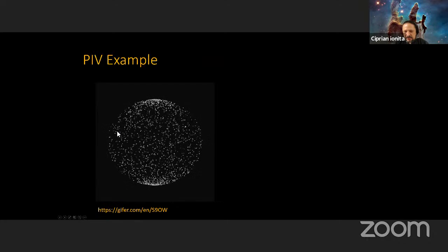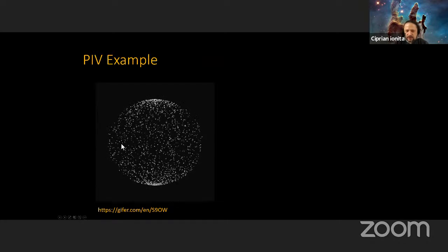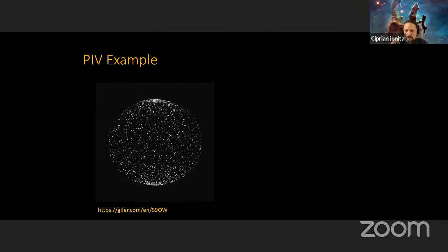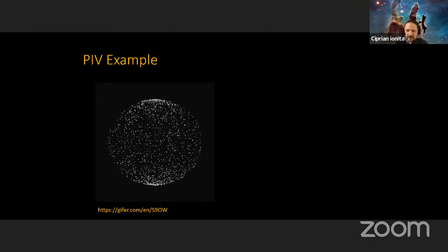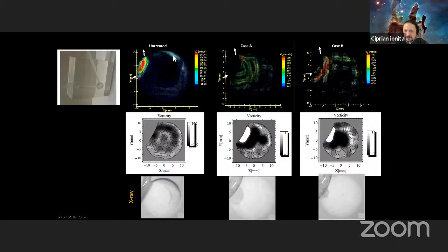It is because we measure them, and this kind of shows the concept. We pass these particles through those phantoms that I showed you with a laser. We shine the laser, and we track small particles all around. All these particles are being tracked, and that gives us measurements like this. So we know exactly the flow, how it goes in. And when we look at the contrast, how it goes in, it exactly follows to a certain degree.